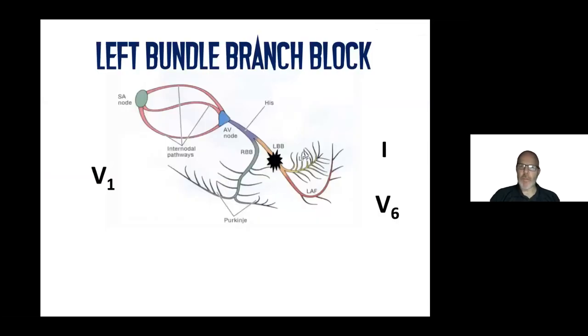Let's talk about left bundle branch block, because left bundle branch block has been the thorn in our side, the bane of our existence, and the whole reason why we want to put a bullet in our head when the cardiologist says you can't call an MI in the setting of a left bundle branch block. You can, okay? You just have to know what you're looking for.